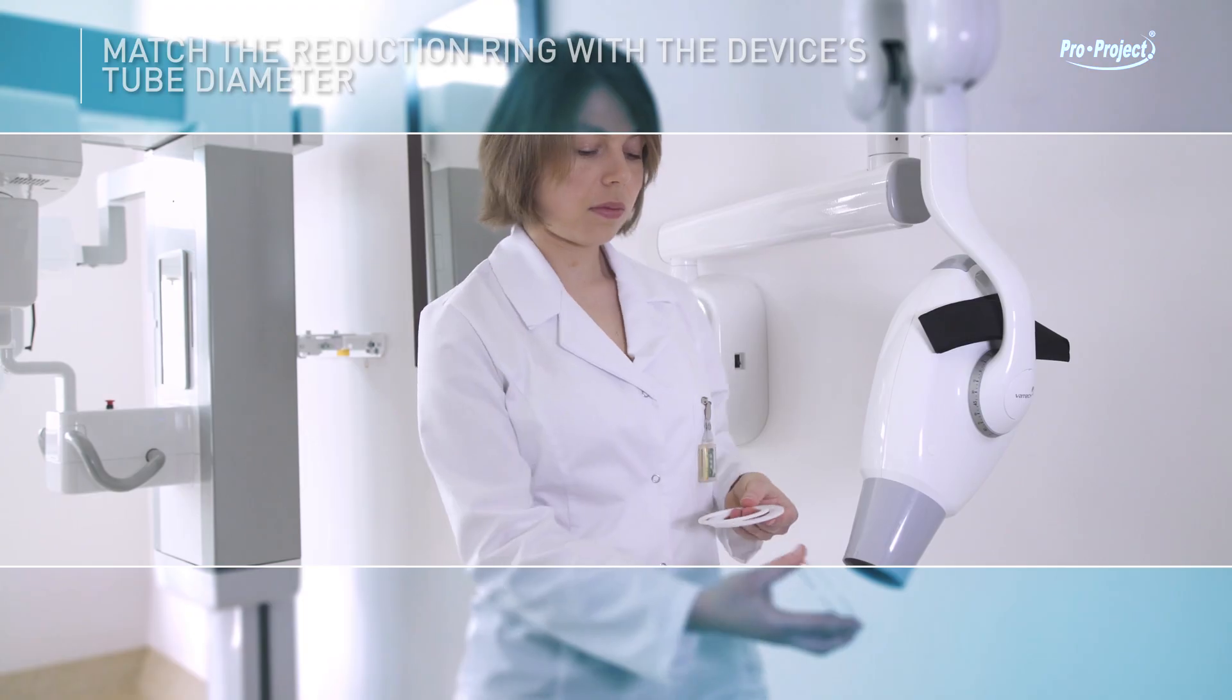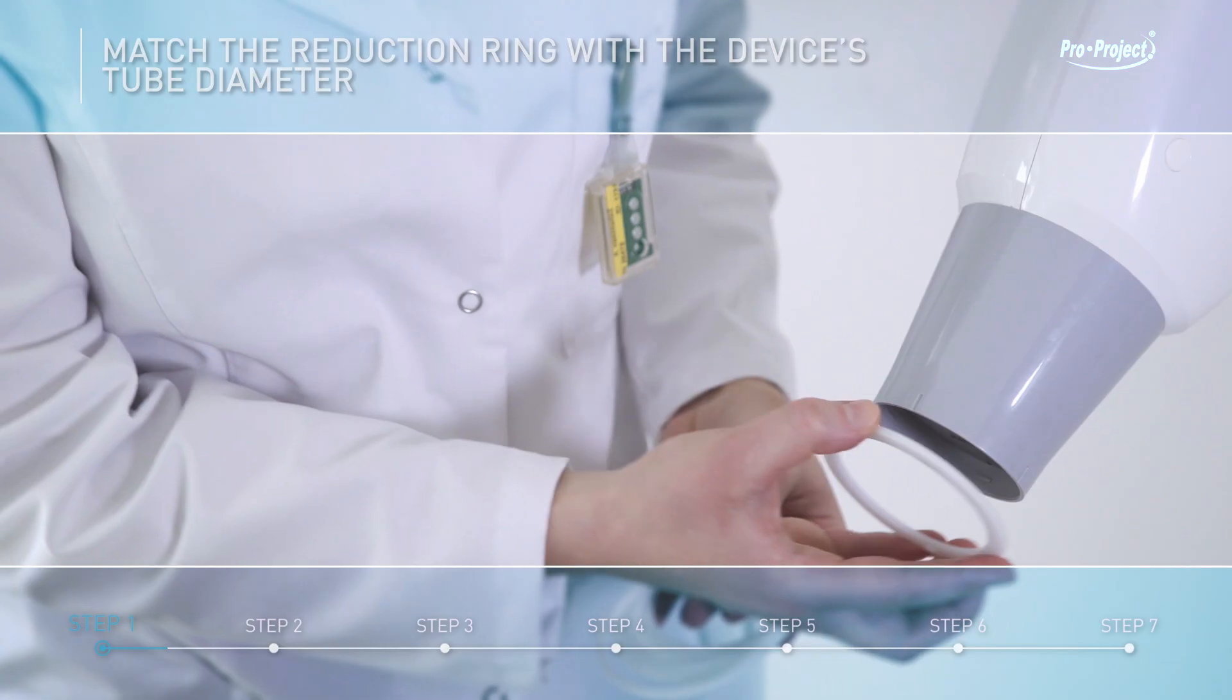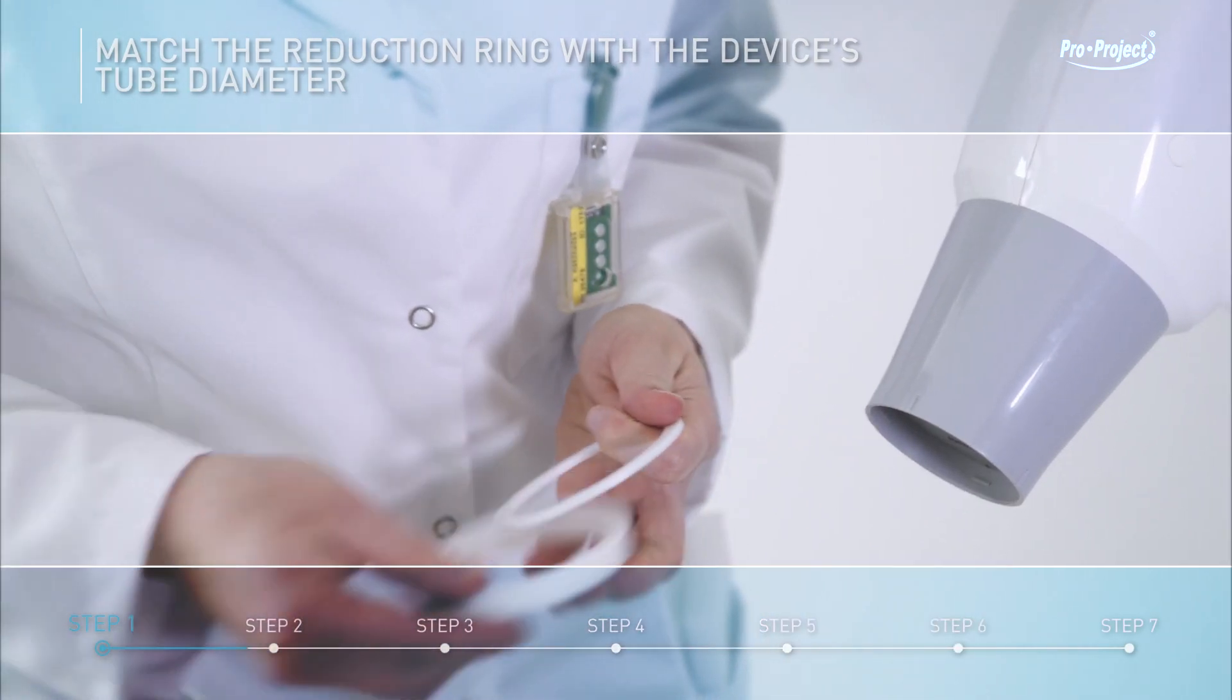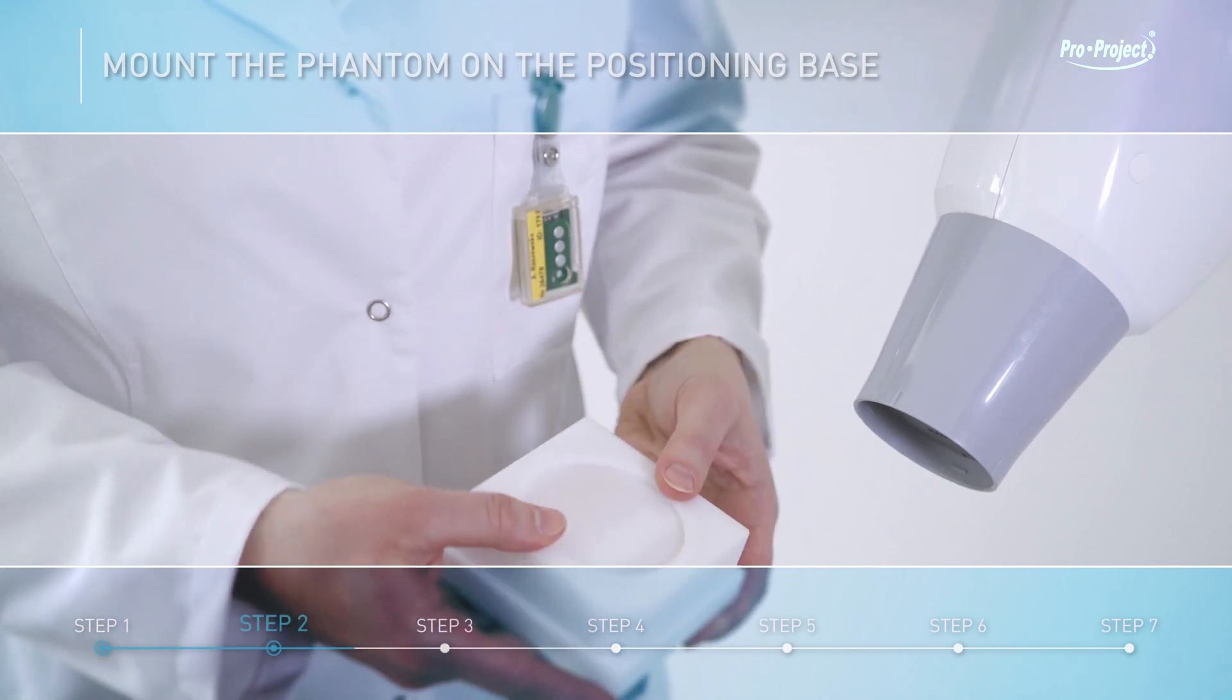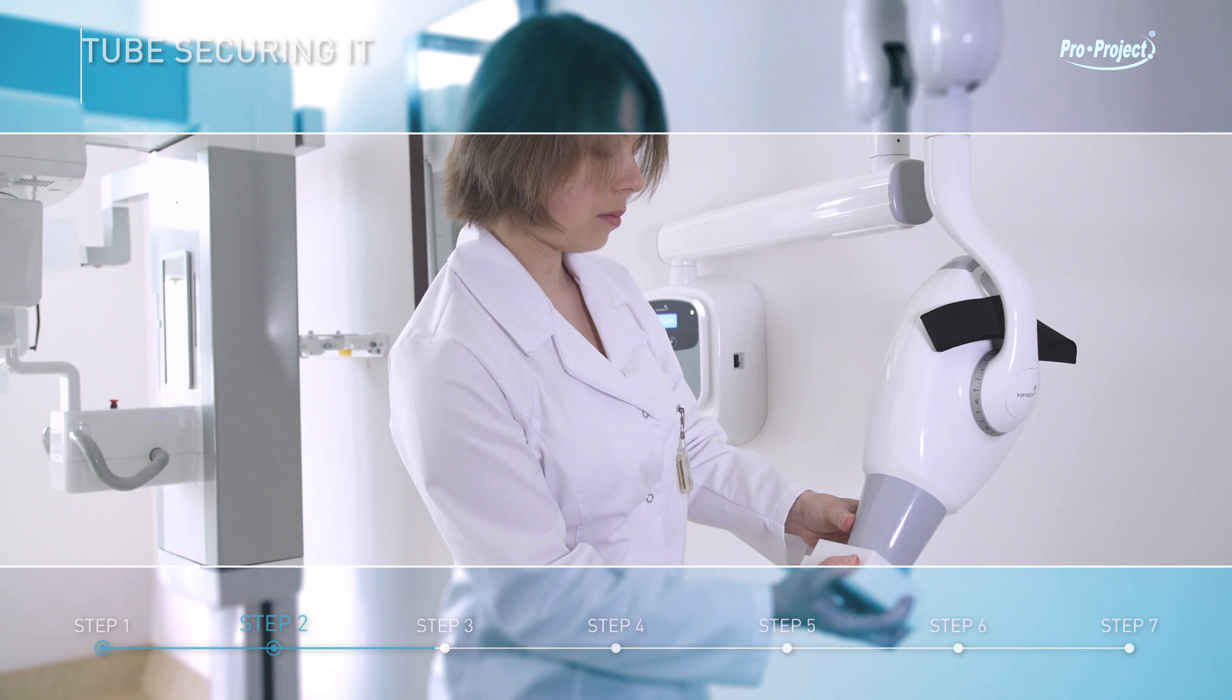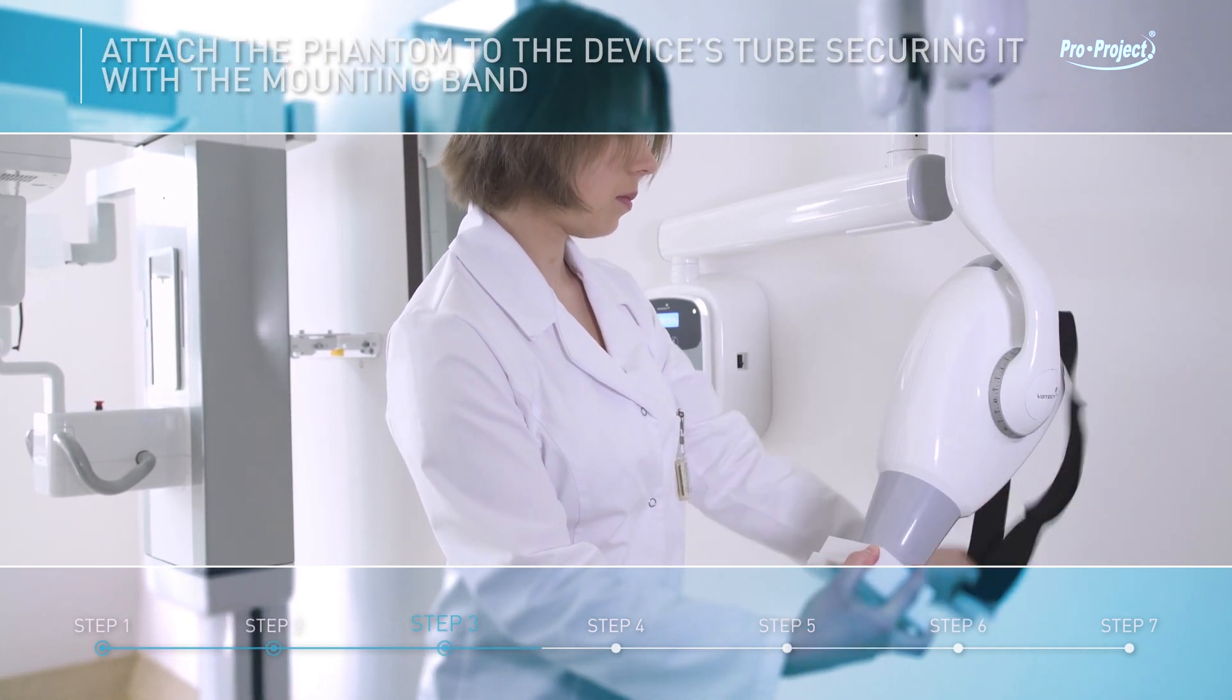Match the reduction ring with the device's tube diameter. Mount the phantom on the positioning base. Attach the phantom to the device's tube, securing it with the mounting band.